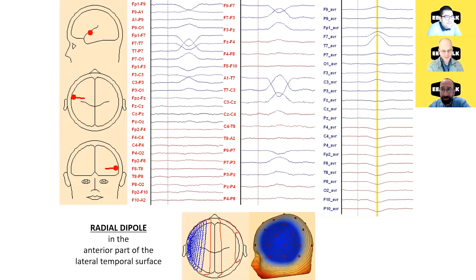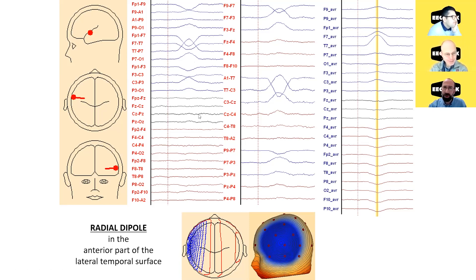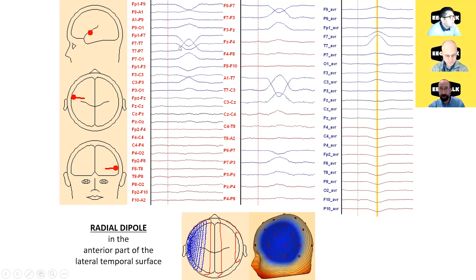Shall I show you some examples? Here you can see three different montages: longitudinal bipolar, transversal bipolar, and common average, along with the two- and three-dimensional voltage maps. Where is the phase reversal? It looks like it's around F7-T7. Exactly — left temporal. Can you see the positivity in the longitudinal bipolar? Not really, but in the common average you can see a widely distributed low-amplitude positivity, and the voltage map shows circumscribed high-amplitude negativity surrounded by that. Your phase reversal works well — the source is just under the peak negativity.